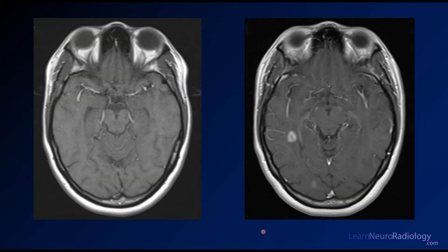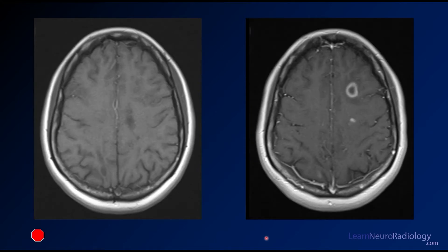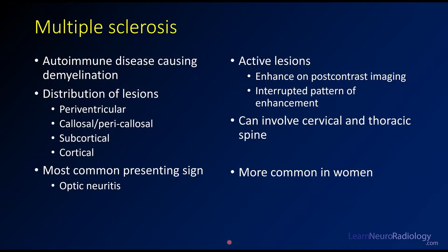Now we have pre- and post-contrast imaging — pre-contrast on the left and post-contrast on the right. You do see there are some areas of enhancement. You might say those are areas of ring enhancement. If you come a little higher, you see it a little bit better — additional areas of enhancement. You have either small areas of enhancement or areas of ring-like enhancement on the post-contrast images.